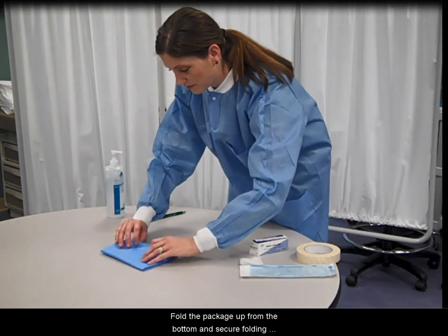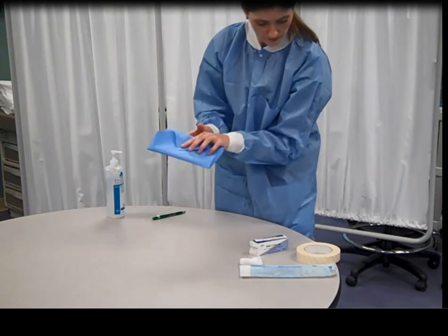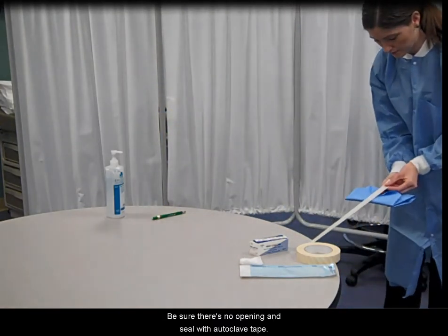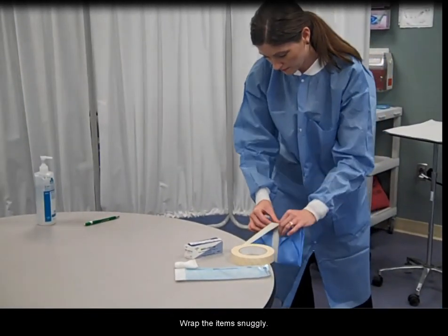Fold the package up from the bottom and secure by folding the last corner back on itself. Some facilities require a second wrapping. Be sure there is no opening and seal with autoclave tape. Wrap the items snugly.